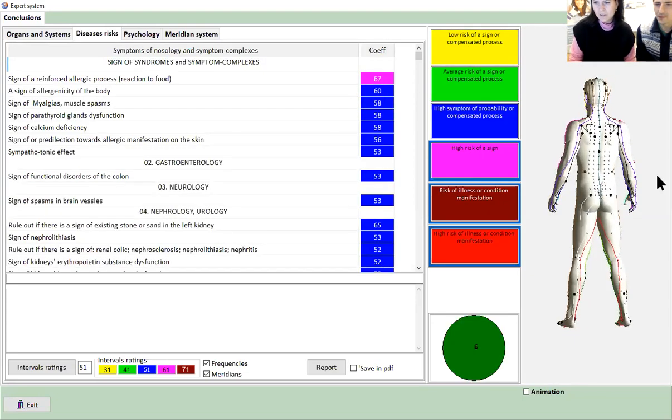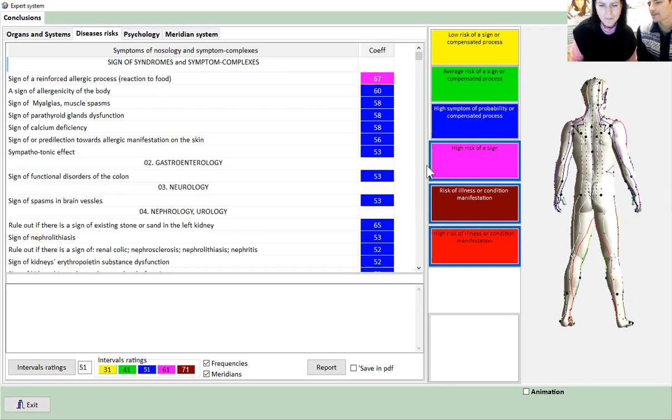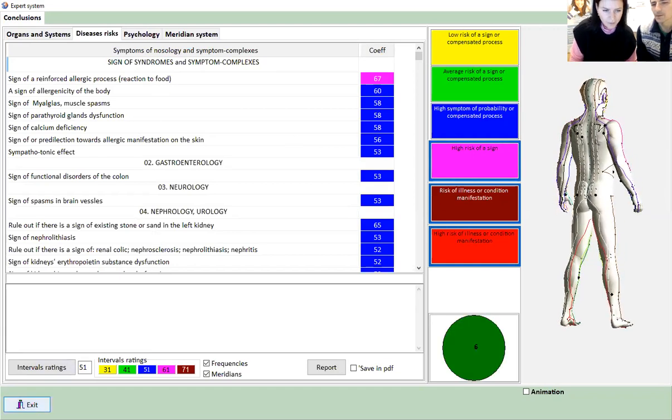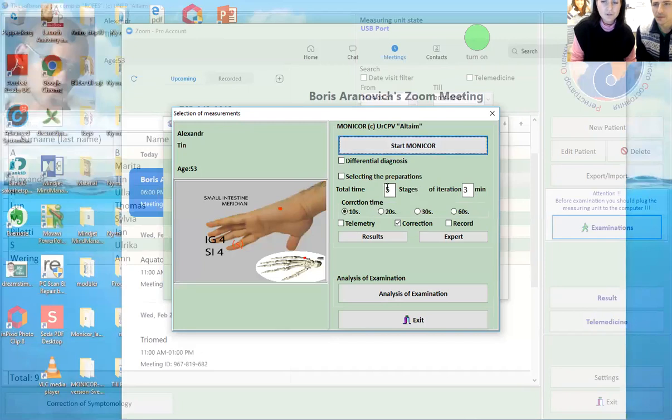So here are all his points that we want to take away. That's wrong, that is blinking. And we go back. So we have to treat him, yeah? Now we go back and just choose the point that is strongest right now in his body. You put the electrode, the right, left hand electrode here, the red color. And wait, I'll show you soon.